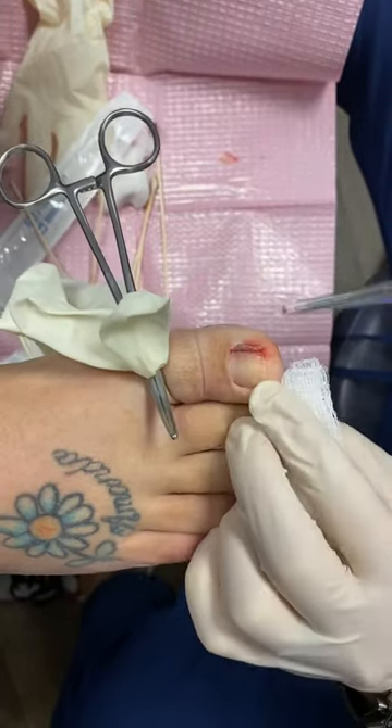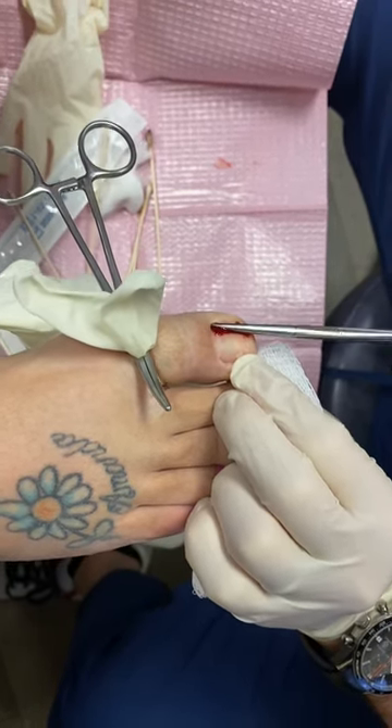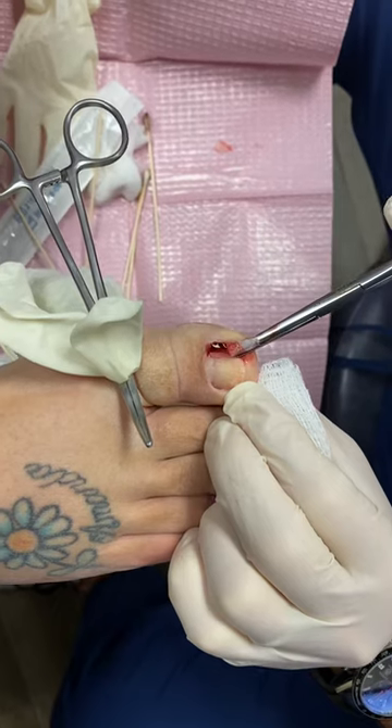She's bleeding a little bit, but we're going to grab this piece of nail, grab it, and twist it. By twisting it, we're taking it out in full. You can see the nail comes out — there it is. That's the piece of the nail.